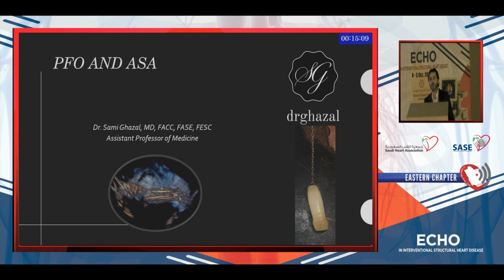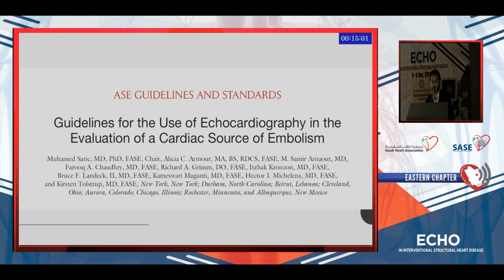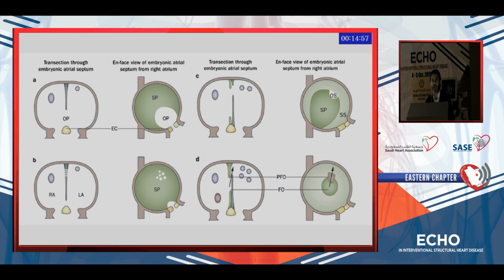So I'm going to talk about the echo assessment of PFO and atrial septal aneurysm. Those are my objectives, and there is a guideline for that which is published by the American Society of Echo. And as my colleague Dr.